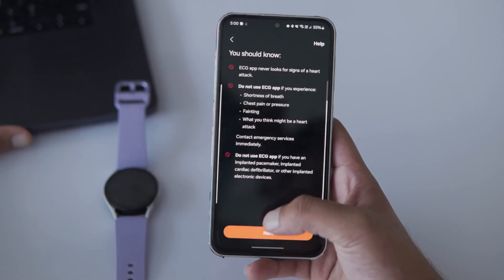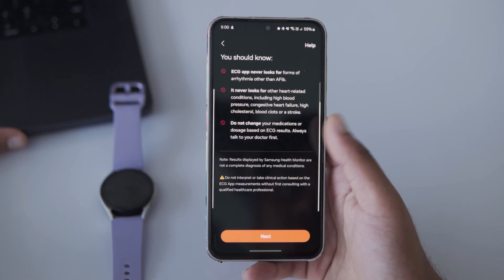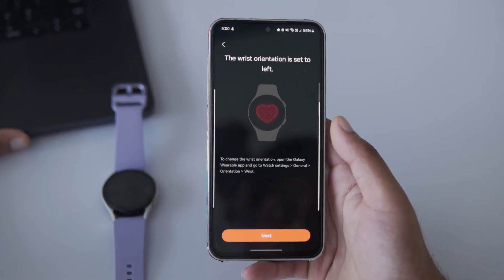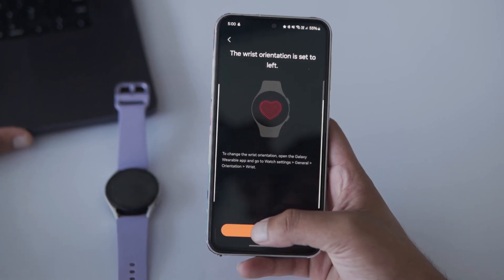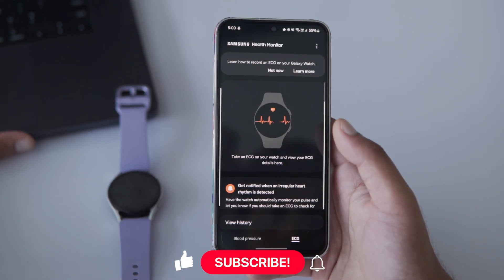The app will tell you a few things to keep in mind before measuring your ECG — tap Next one more time. My wrist orientation is set to Left, which works for me, so I'll just tap Next. And that's it — everything is ready. The watch is set to measure your ECG.